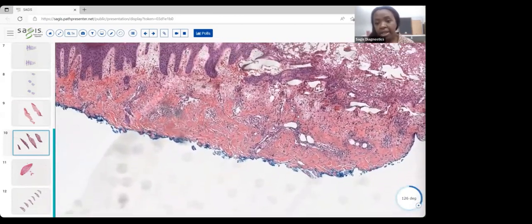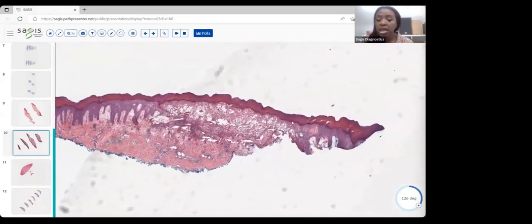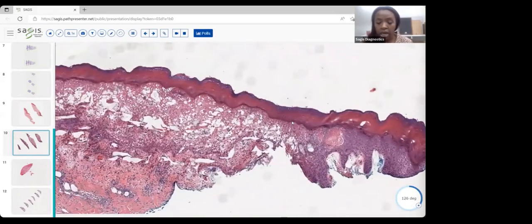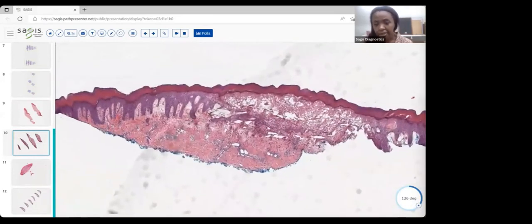Okay, so again, this was acral. We have that pattern of reticular degeneration without any multinucleation or the development of intracytoplasmic inclusions. So this happens to be hand, foot, and mouth syndrome, which is typically caused by Coxsackie 16, and enterovirus 71 is less common, but can be associated, of course, more in kids. So kind of the right clinical picture too. But this is an example of hand, foot, and mouth syndrome. So just again, keep in mind that we have a reticular degeneration and balloon degeneration without the specific viral cytopathic effects, so to speak.